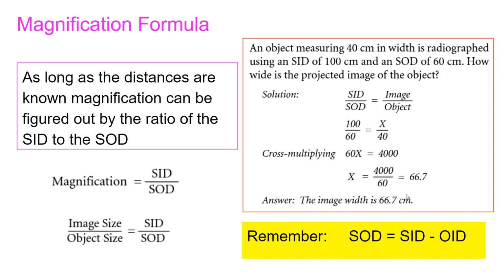It's always going to be higher than what you started with. So you should be able to eliminate at least one answer on a test, right? Because there's always going to be some inherent magnification. So automatically, if you get a number that's lower, then you did your math wrong, right? So keep that in the back of your head. That's a pretty big difference, though, right?